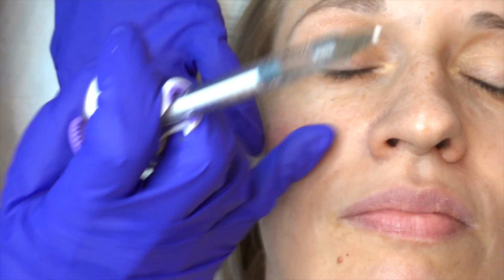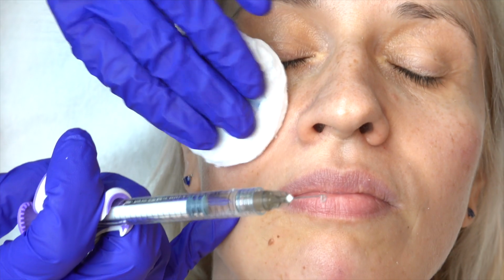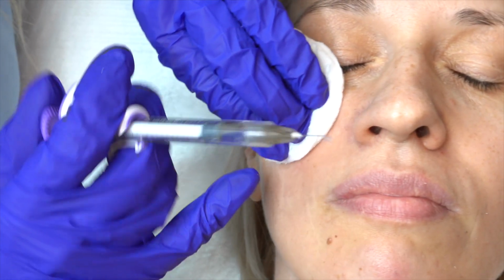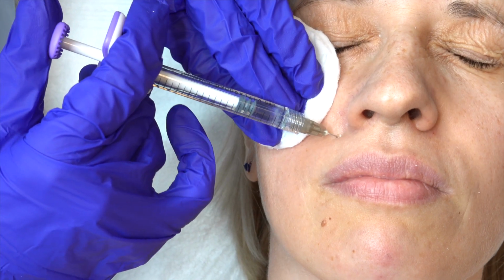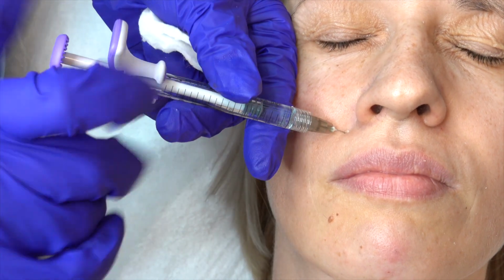I will give my patient a little bit of time. Here is the ligament, buccal maxillary ligament. You just pull the skin with the ligament and go under the ligament right here. And again make an aspiration test.